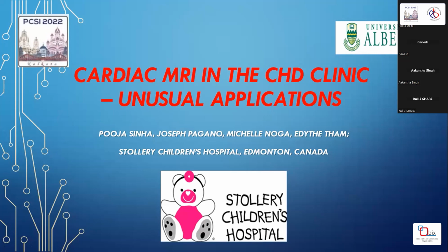I'll just wrap up this session with a few interesting cases that highlight unusual applications of cardiac MRI in the management of congenital heart disease.